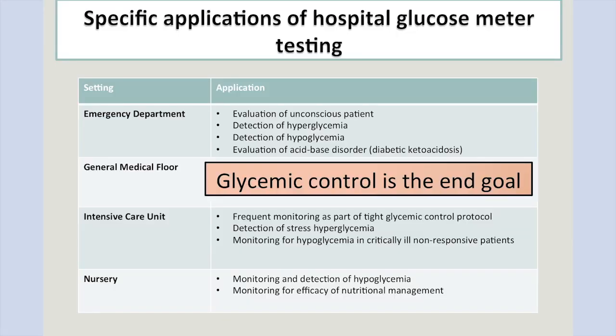We're all really worried about identifying them. The last thing we want to do is miss a baby and overcall the glucose when the baby is actually truly hypoglycemic. Those are the two areas in the hospital that we're concerned about with glucose and using glucose meters.